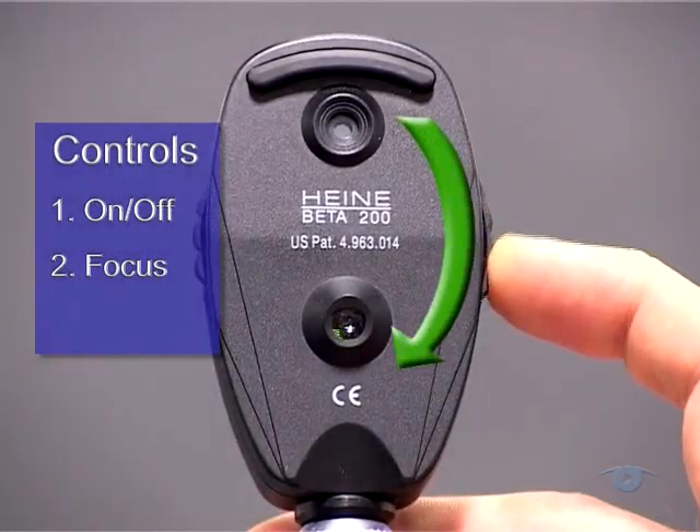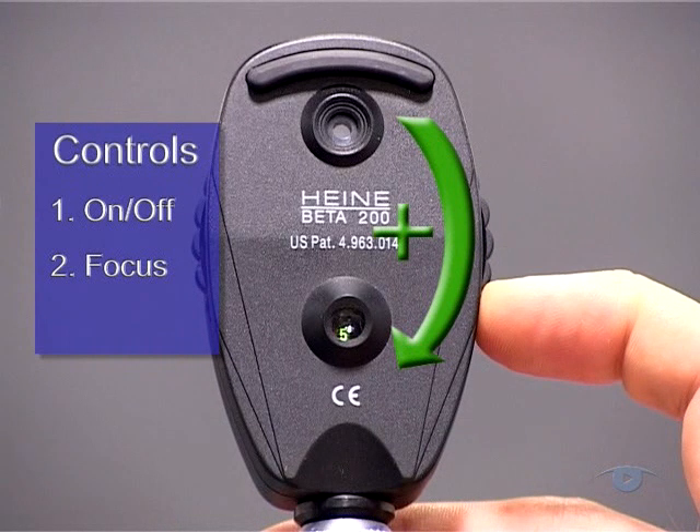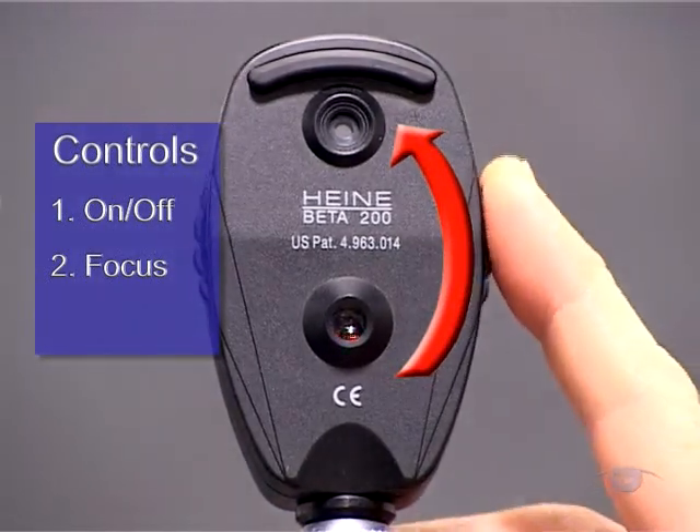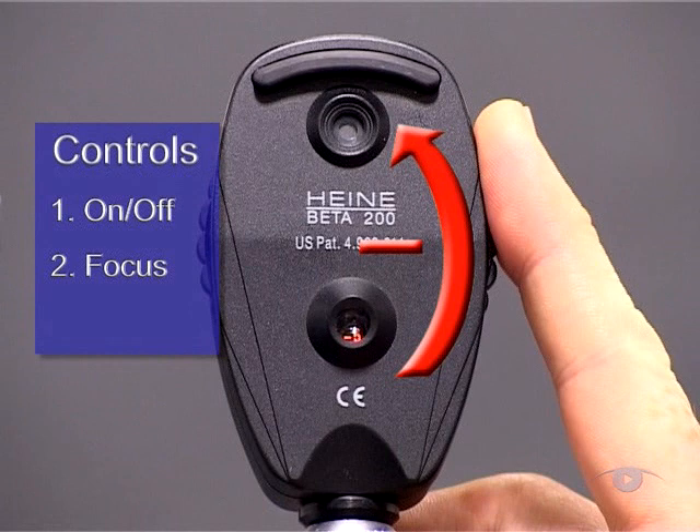Dialing this wheel clockwise increases the lens power, which moves the focal point nearer the observer. Conversely, anti-clockwise rotation effectively decreases the power of the intervening lens, which moves the focal point further away from the observer.